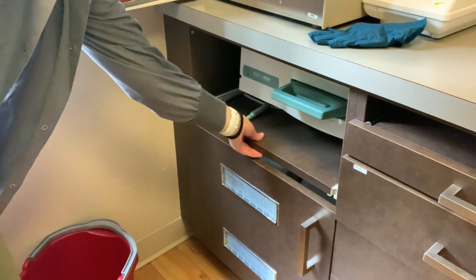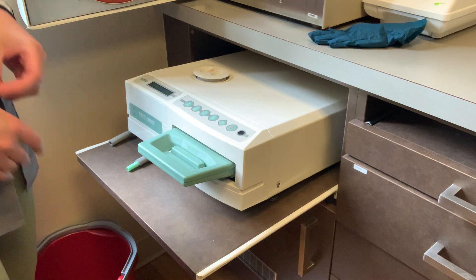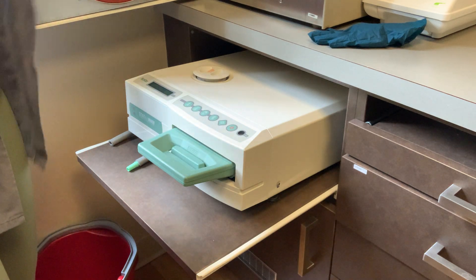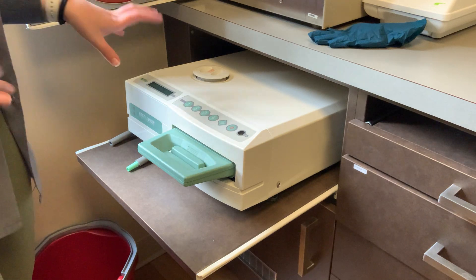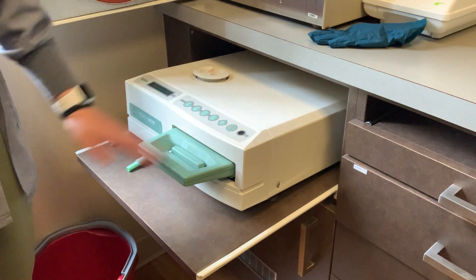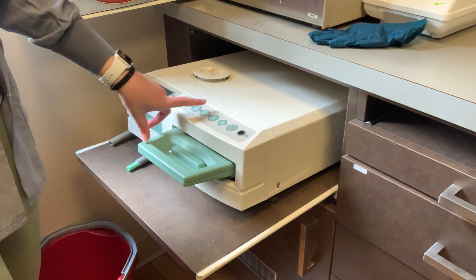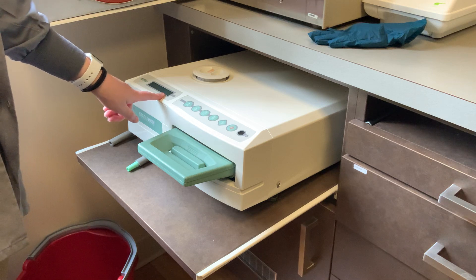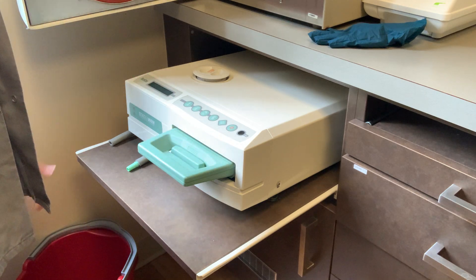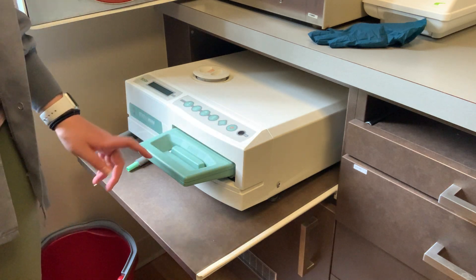The other autoclave in this office in Chantilly is called a Statim. This is going to be used when we need something quickly, or if we have a busy day and are trying to catch up. You can put things in it as well. It has the same settings: unwrapped and pouch. There's one setting for rubber and plastic, but we don't use it because we don't have anything in our office that we'd need that for. Then you have start and stop.